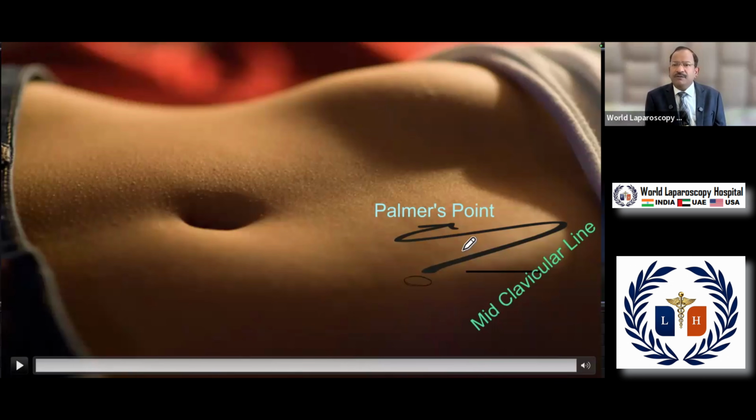That is why many of the surgeons do natural orifice transluminal endoscopic surgery through the transgastric route. If you type in Google transgastric cholecystectomy, you will get many videos where they put the endoscope through the mouth, they perforate the stomach and then they remove the gallbladder through the mouth. So, that is why I say that the stomach is a good organ to perforate. Even if it is perforated, you should not worry, it will heal on its own. You only have to take a bite and put a nasogastric tube and keep the patient nil orally for a couple of days.